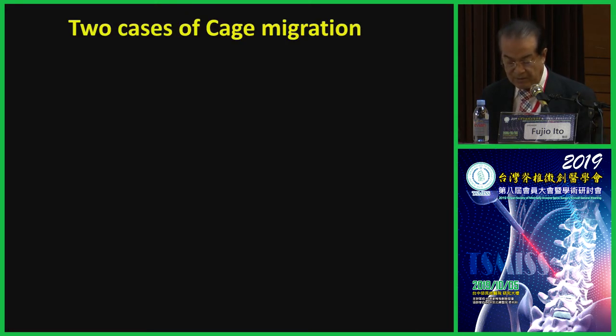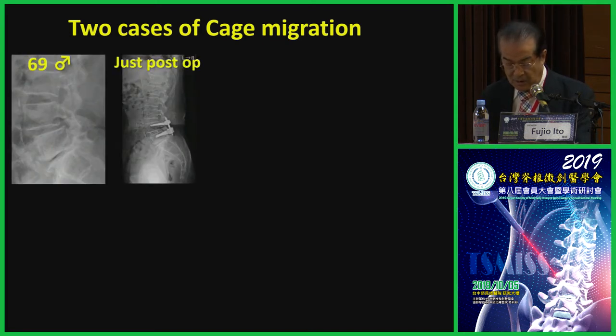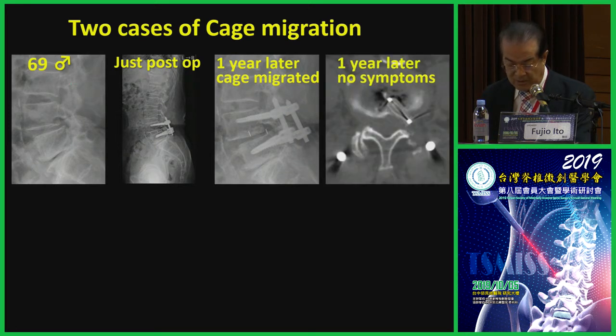There are two troublesome fusion cases of cage migration. This was a 69-year-old male. The cage was set in the correct position just post-operation. 1 year later, the cage had migrated toward the posterior left side. However, it was lucky. He had no symptoms and could walk even for 1 hour without pain.